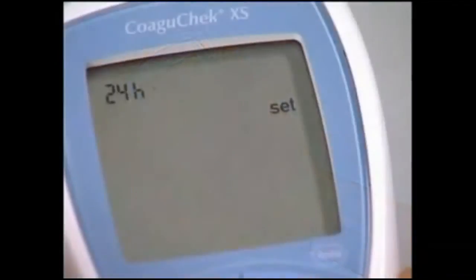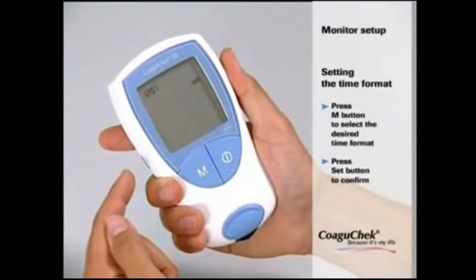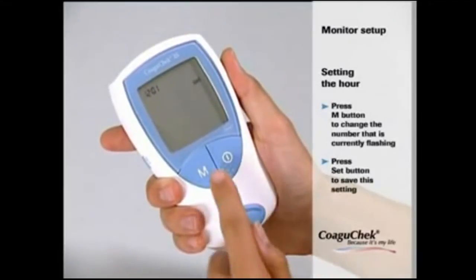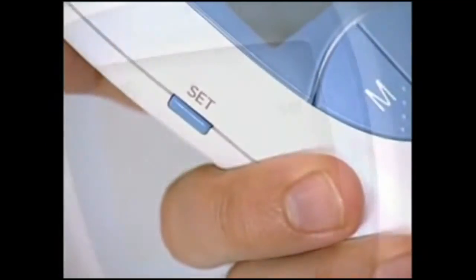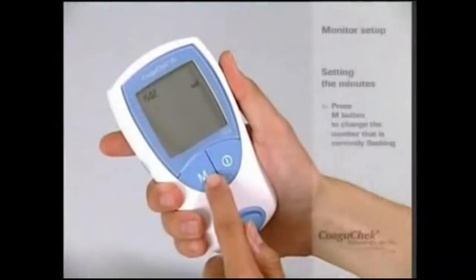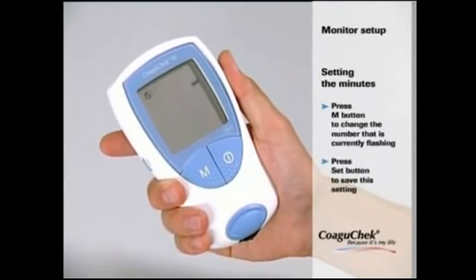The display now changes automatically to the time format setting. Press the SET button to confirm the desired format. The display then changes to the time setting. Press the M button to change the hours and save, then repeat to adjust the correct minutes. Finally press the SET button to save the new time settings.